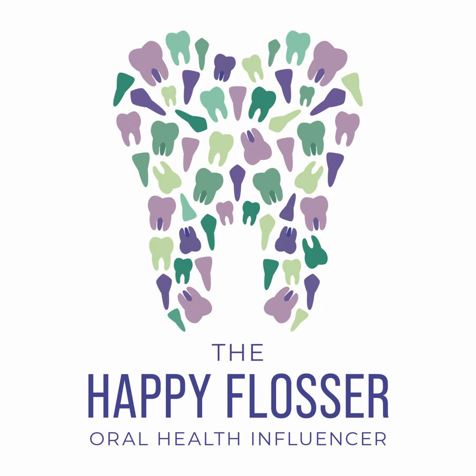You are responsible for taking diagnostic radiographs so that the dentist can detect early decay and periodontal disease. And it is important for you to have the sensor in the right positioning and have the correct angulation of the PID so that you can take the right image to have early detection of those two dental diseases. This is your responsibility as a clinician, and diagnostic radiographs are part of the standard of care.